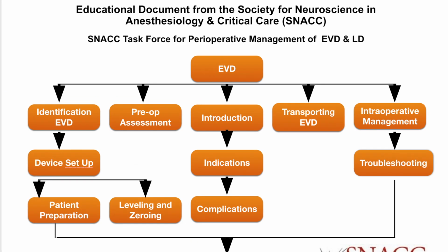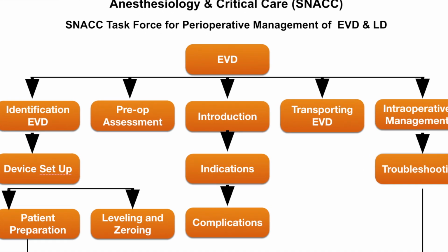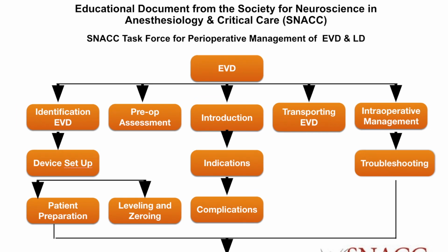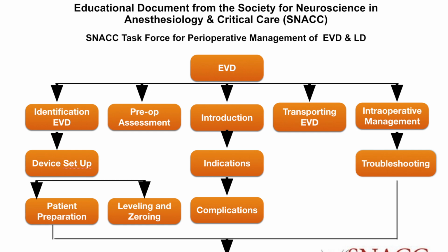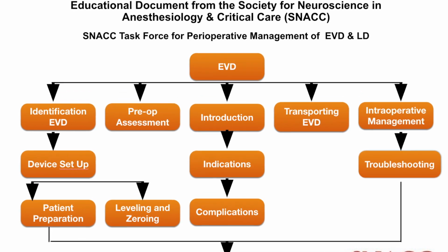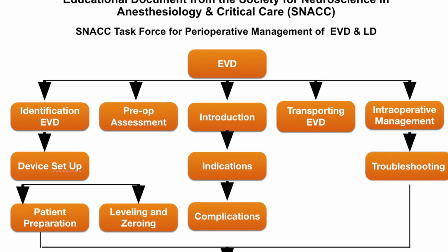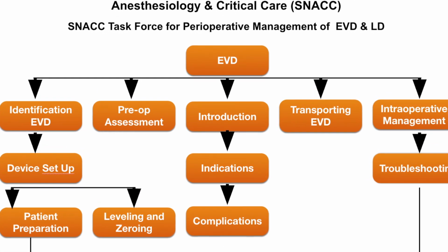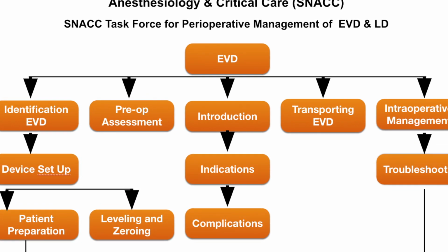In this video, we will discuss the common indications for external ventricular drain placement. We will discuss how to set up, level, and change the height of the external ventricular drain collecting system. In addition to a preoperative assessment of a patient with an EVD, we'll also talk about transportation of patients in a safe manner, as well as the intraoperative management and EVD waveform interpretation.